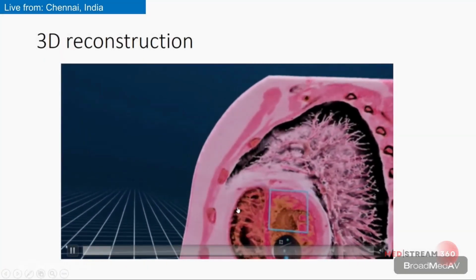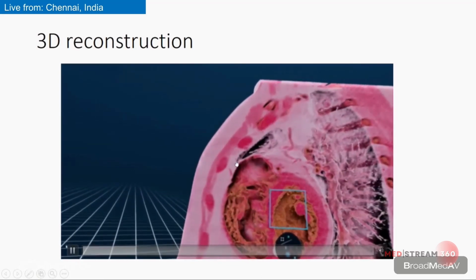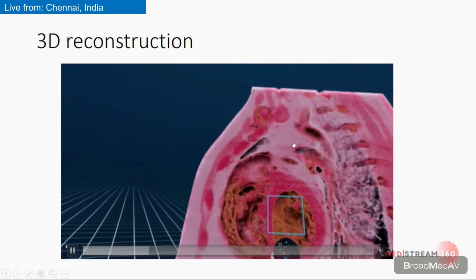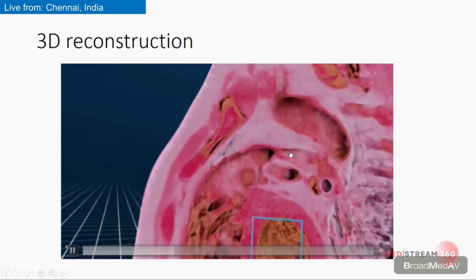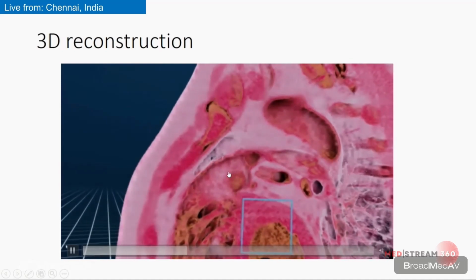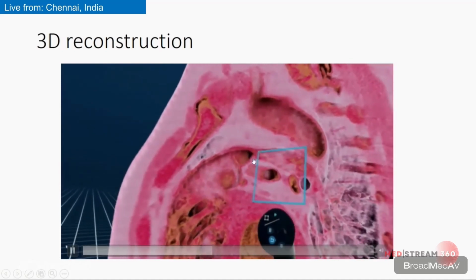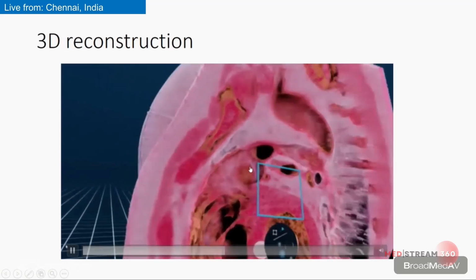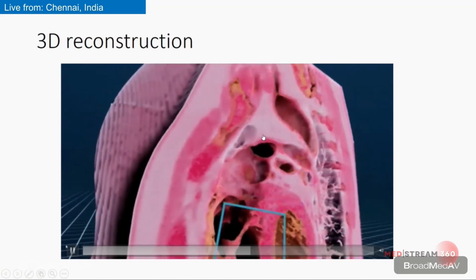Here we can see this is the dilated and trabeculated right ventricle. This is the right ventricular outflow tract, and I am slicing towards the LPA. This is in the lateral or sagittal view. This is the RVOT. This is the LPA origin, which is narrowed, and this is the hilar LPA. Now I will show this is the RPA origin.